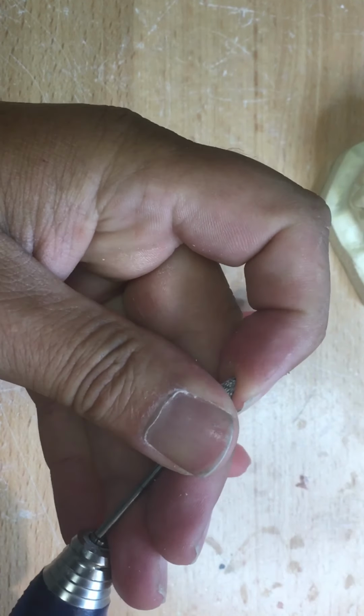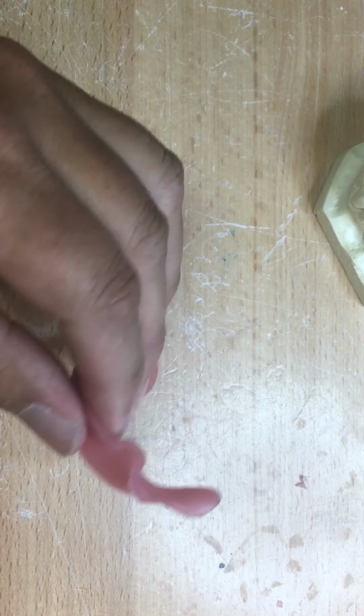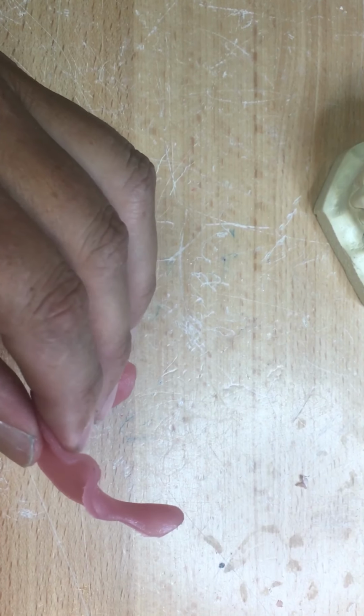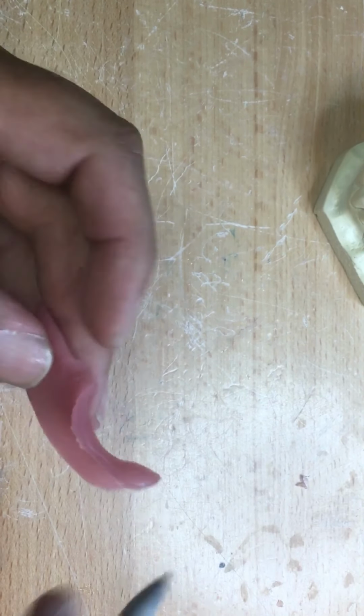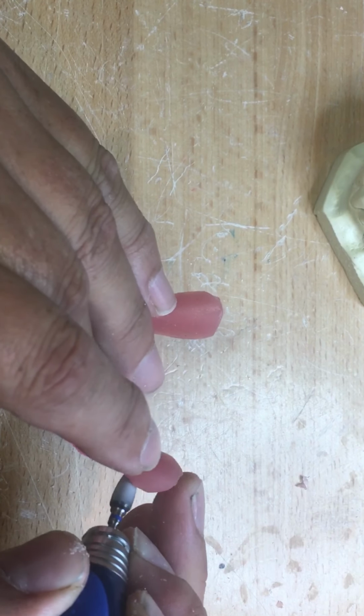Not a real good look, so to speak. Not to mention the trauma it would cause to the underlying dental structures would be disastrous. So I'm going to turn the suction on here just for a second. And the rough edges that I created when I was trimming, I'm going to smooth them off.